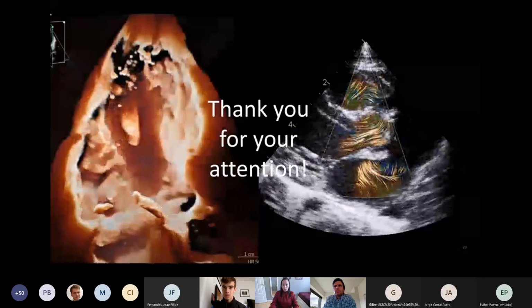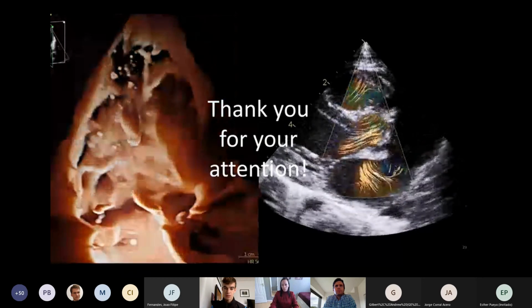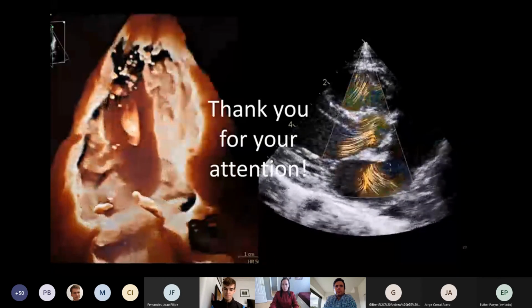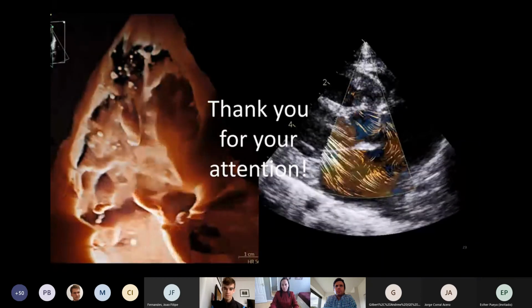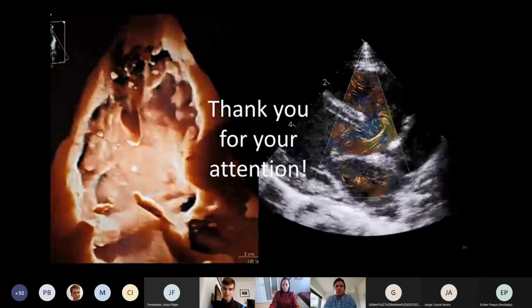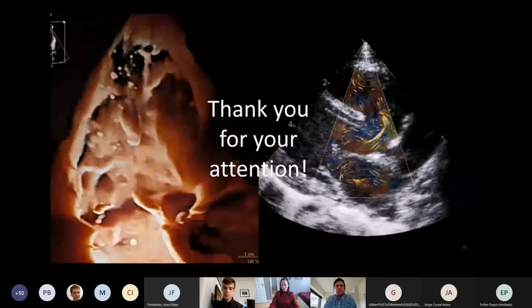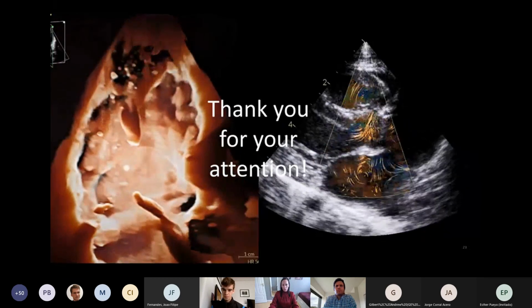Indeed, we prioritized deployment in pediatrics first, since that's the area where analyzing the blood flow is most critical. It is not so easy to get, in general, good imaging on an adult with a pediatric probe. So it's not ideal to try and use the probe on yourself. But there's nothing limiting the technology. It's just a matter of tweaking the parameters so that it's suitable for the different probes. So it is planned that we would extend this type of imaging to adults as well.